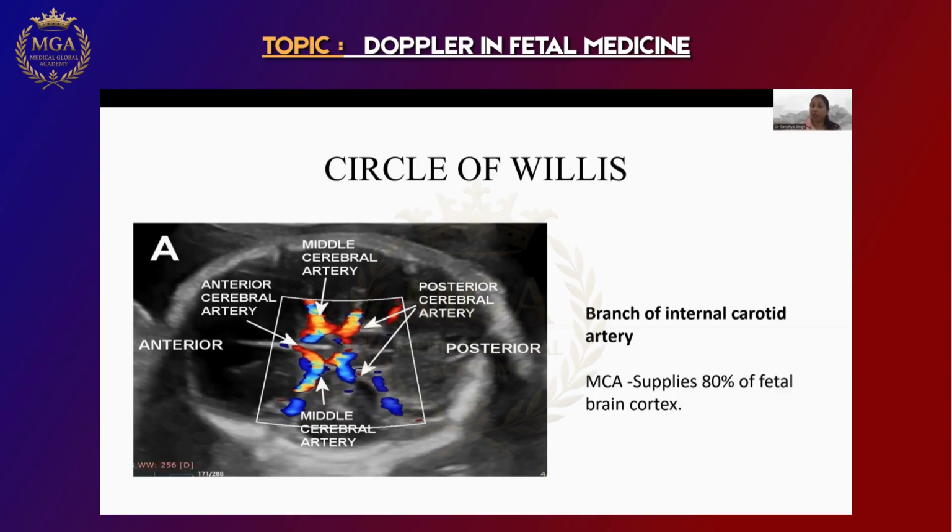Therefore, whenever hypoxia is happening, the brain vessels will dilate so that we can compensate. Because what does hypoxia mean? Hypoxia means that the amount of oxygen dissolved in the blood is less. Point number one. So when the amount of oxygen dissolved in the blood is less, we want to change the blood more frequently. So what will we do? We will increase the flow in the brain. How can we increase the flow? By decreasing the pressure of the artery which is supplying.